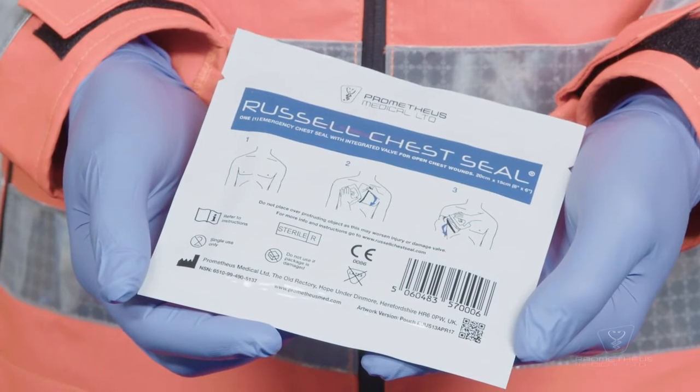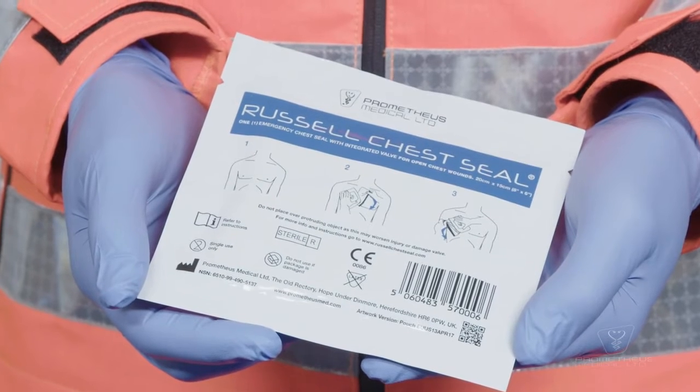I'm Dr. Richard Lyon and in this video I'm going to demonstrate how to use the Russell chest seal. This device is designed to treat open pneumothorax by allowing excess air from inside the chest cavity to be expelled through the device in one direction to help facilitate lung reinflation and minimize further collapse.